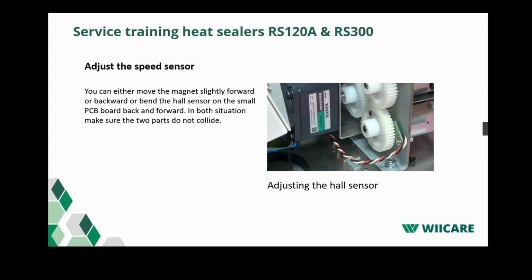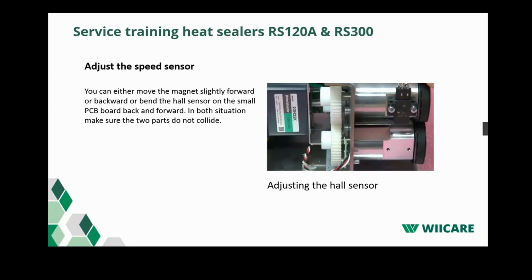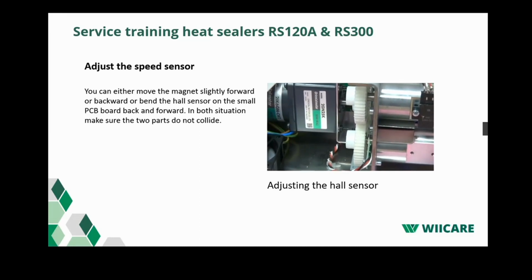You have to be careful as well with the magnet. If for one reason or another you take it out, always put it back in the correct way. Otherwise, the speed sensor would not work. The magnet is located in the gear with the speed sensor. Make sure they are well aligned with each other. You can push the magnet closer to the sensor to decrease the value. If you push it backwards, you increase the value of the speed.